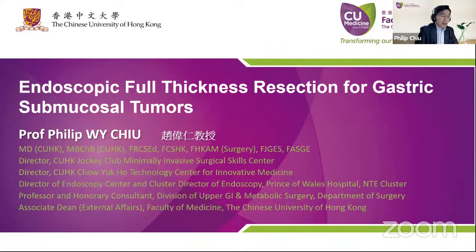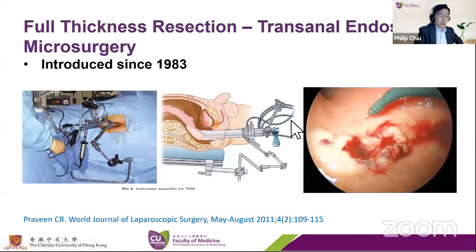Today my topic is endoscopic full thickness resection for gastric submucosal tumor. I'd like to congratulate Professor Linghu and all our team members that we have successfully started this super minimal invasive surgery group under WEO. So I think it's really nice for me to follow Professor Federov's talk, because I'm going to present about full thickness resection for gastric submucosal tumor.